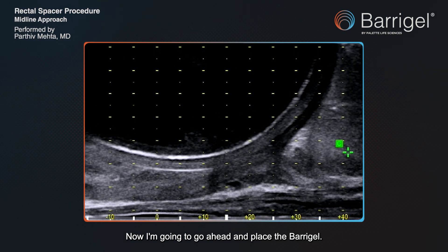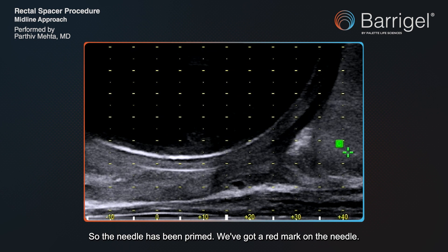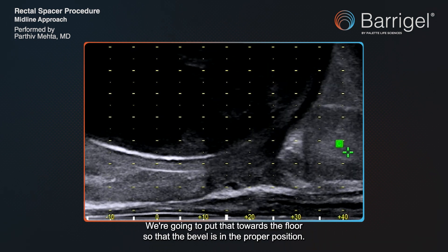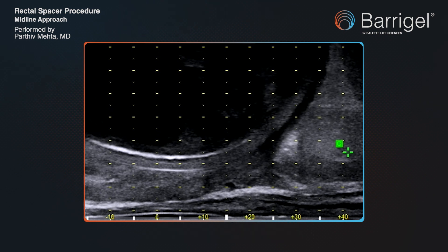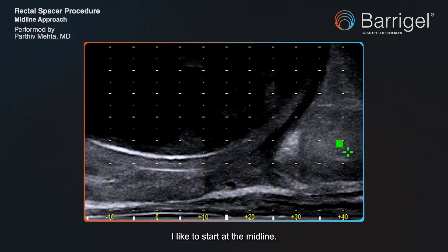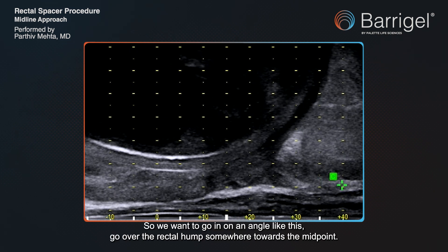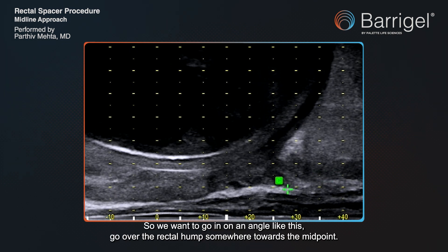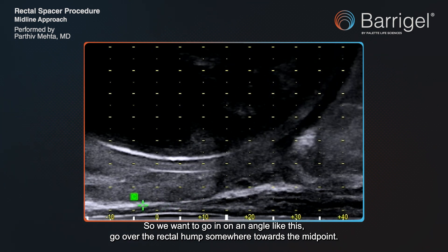Now I'm going to go ahead and place the Barrigel. The needle's been primed. We've got a red mark on the needle — we're going to put that towards the floor so that the bevel's in the proper position. I like to start at the midline, and the goal is to go over the rectal hump, so we want to go in on an angle and go over the rectal hump somewhere towards the mid-gland.